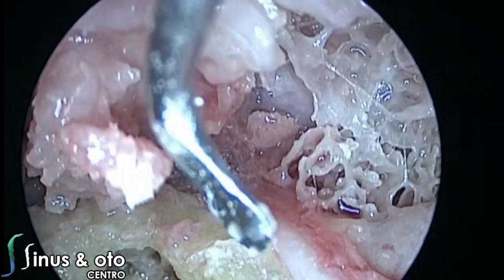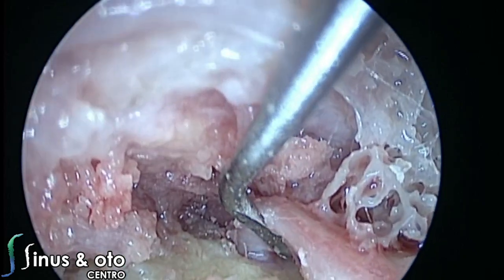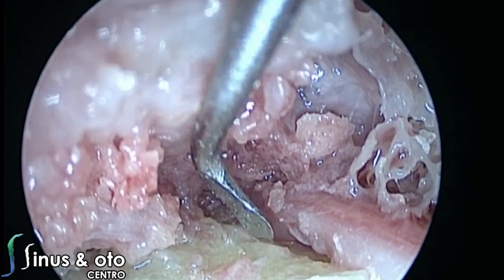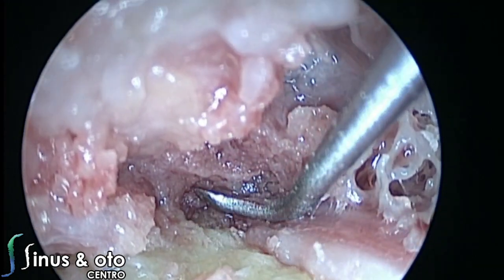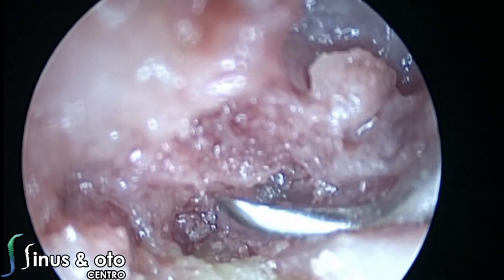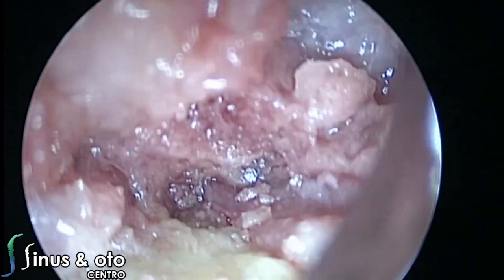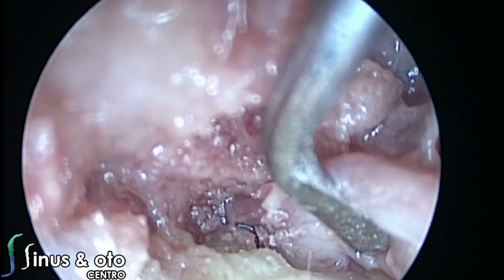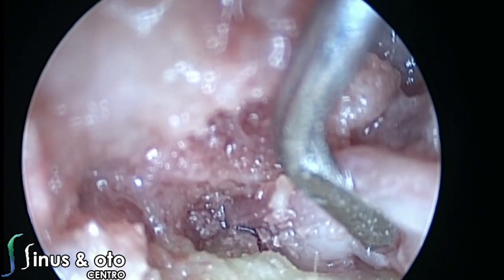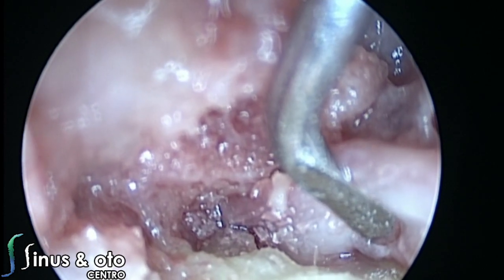We can elevate again the facial nerve, the tympanic segment of the facial nerve, and then we see one going inside, going down in this direction, which is the labyrinthine segment of the facial nerve, which is the weakest segment of the facial nerve, and then another going in this position, which is the greater petrosal superficial nerve. So again, it's a very nice endoscopic anatomy, and of course you can see this through the microscope or through other different instruments, but sometimes according to the approach and the instrument that you use, you can have different views and different configurations.